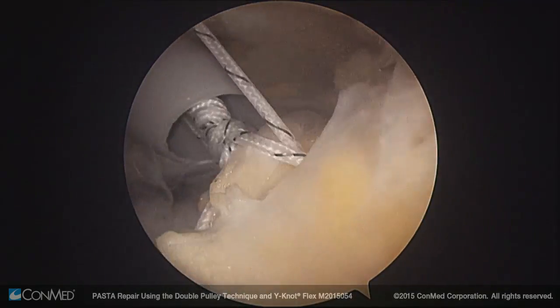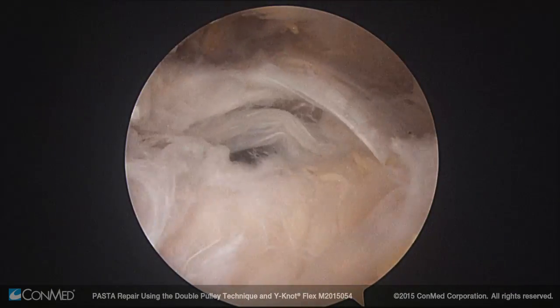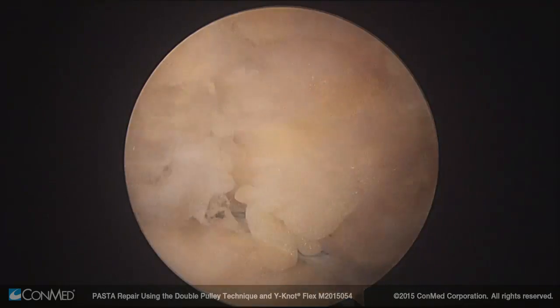To complete the second pulley, repeat the same steps but use the other colored suture. The final construct will show the supraspinatus tendon compressed back down to bone.